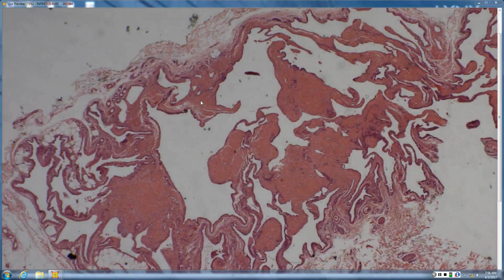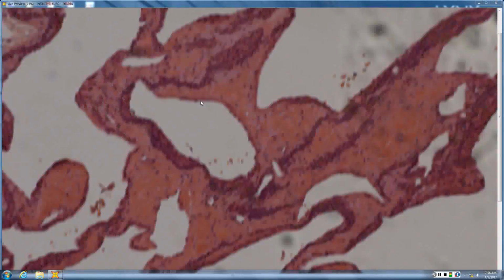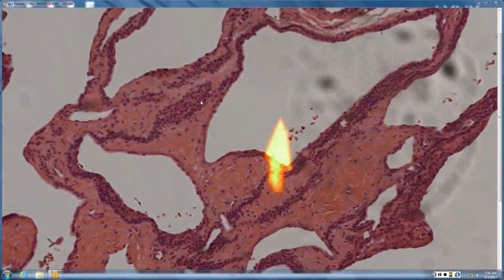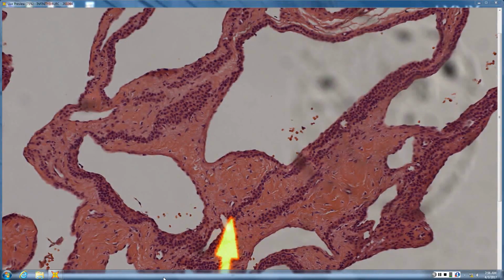So it's definitely vascular. And then what do you have lining the edges? You have at least a double layer, in some other places an even thicker layer, of small pink cells that have very round nuclei. They look like glomus cells to me. Yeah, they look like strings of black pearls.